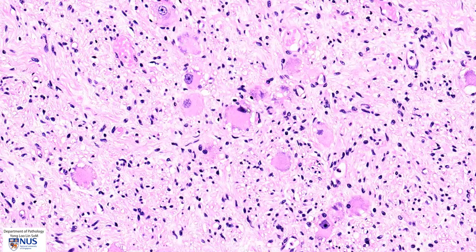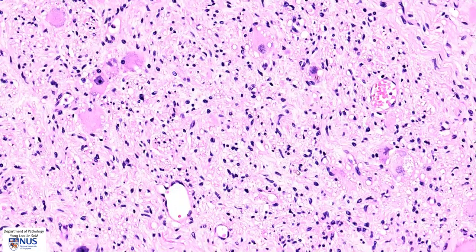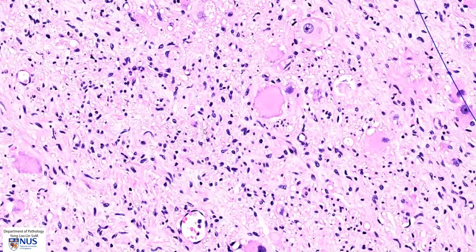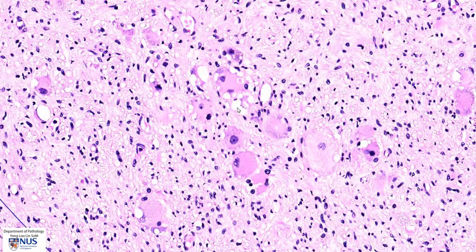Some of these ganglion cells have very dark, smudgy-appearing chromatin. These are the pyknotic nuclei, and these are examples of dysmorphic ganglion cells. Dysmorphic ganglion cells can also be binucleated or multinucleated. Here is an example of a binucleated dysmorphic ganglion cell, and another example here with two nuclei.